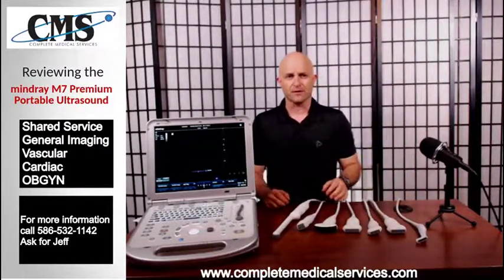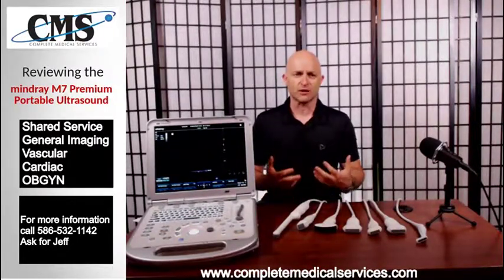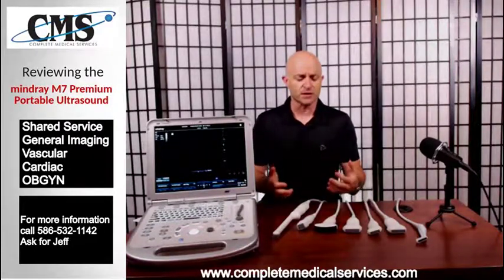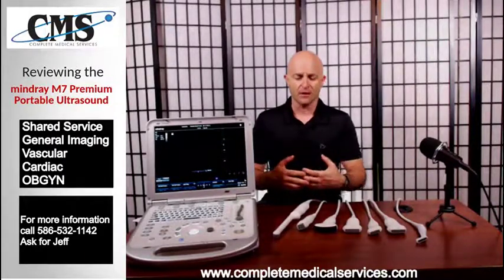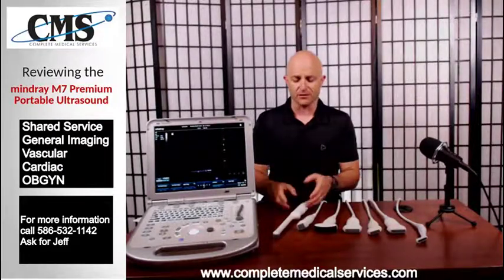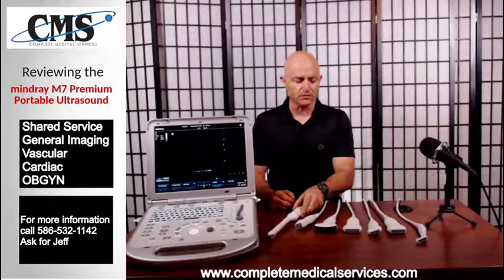Let's look at different possible ultrasound configurations based on the transducers here. When we talk about shared service, what do we really mean? Shared service means that the system can pretty much function and scan for any specialty — cardiac, abdominal, small parts, vascular, and it may also include OB/GYN or endocavity studies with the endocavity transducer.